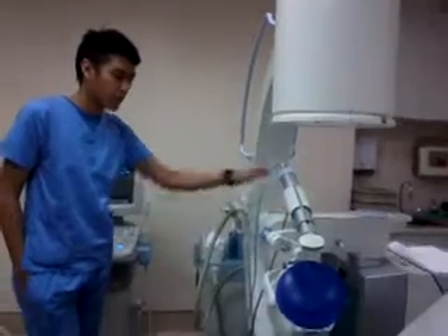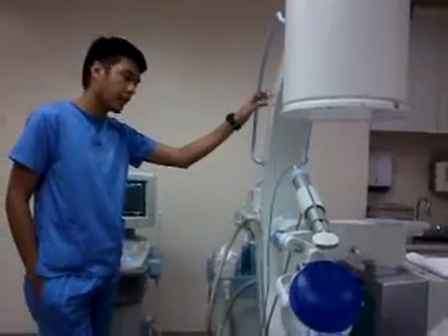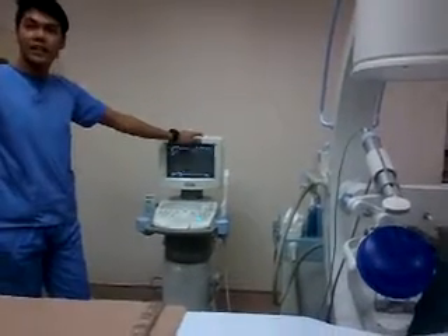It's a harder way of imaging the stone because, unlike in other settings, we cannot view the stone in the ureter by simply using the ultrasound machine.